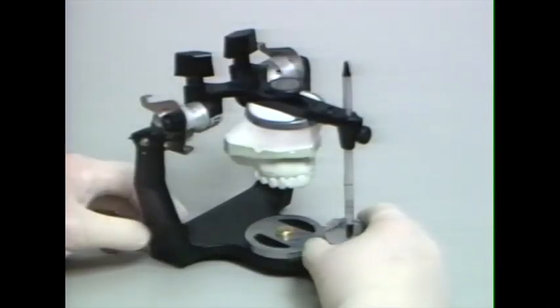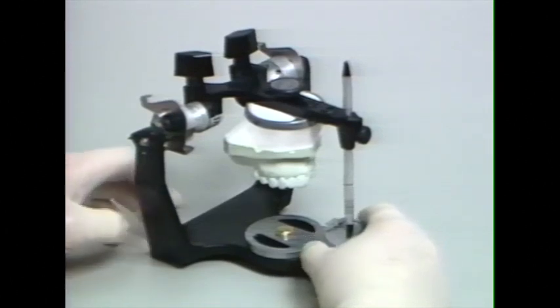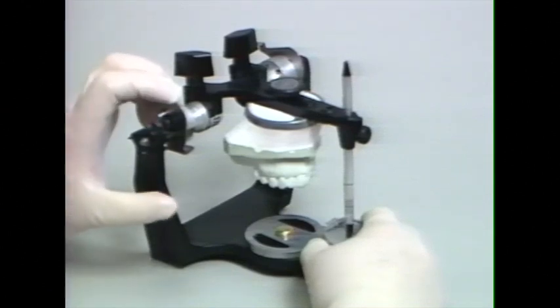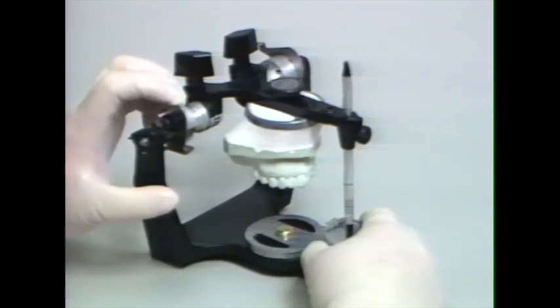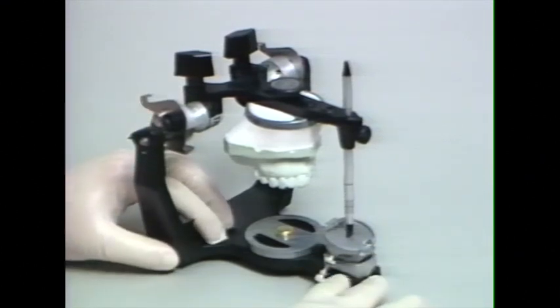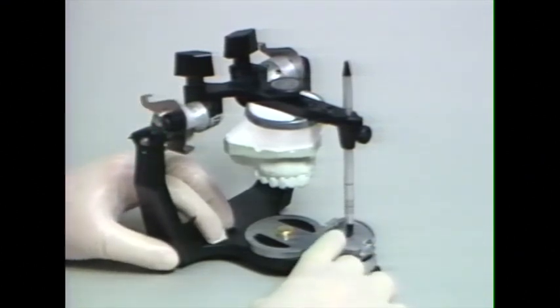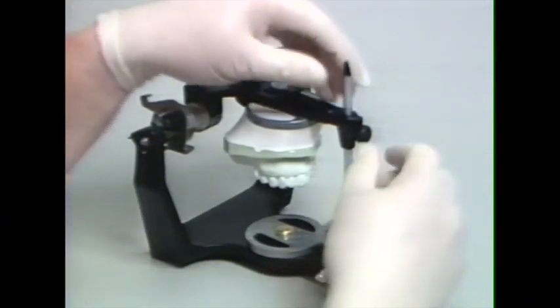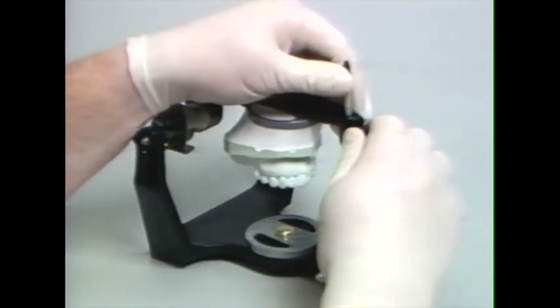At this point, we have mounted the maxillary cast. To prepare the articulator to mount the mandibular cast, we need to continue to have the articulator locked in centric relation. We set the incisal guide table so that the mark on the incisal guide table is even with the incisal guide pin, and we need to set the level of the incisal guide pin.